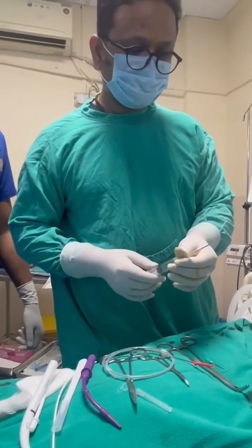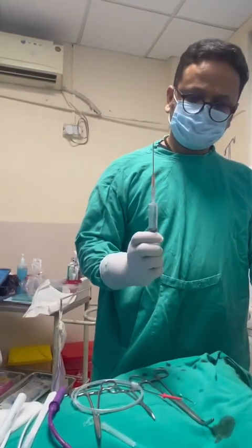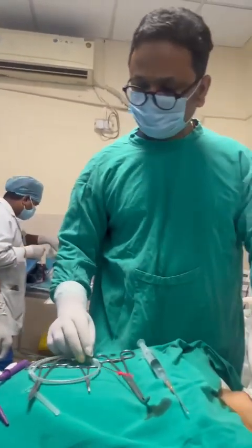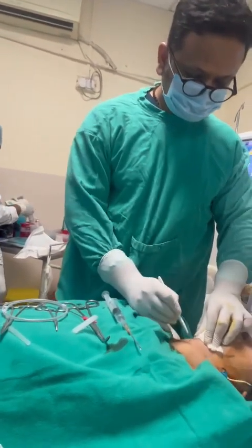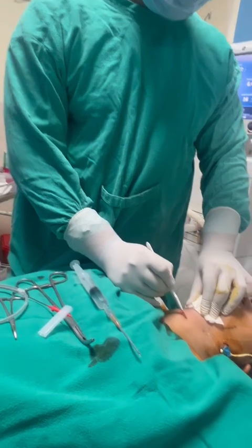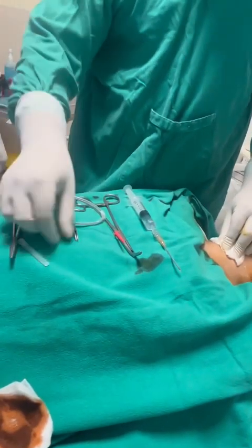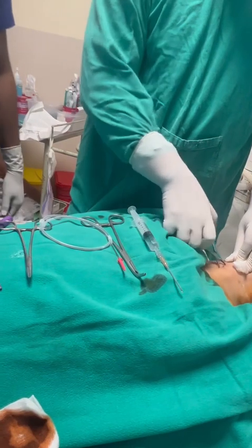With the tube, the cuff you will have to deflate. Please give me a disposable. I'm making a skin incision. So now there will be, you have to do a blunt dissection, right?